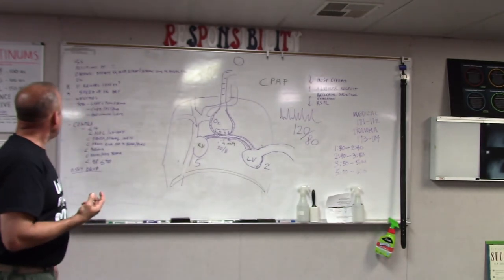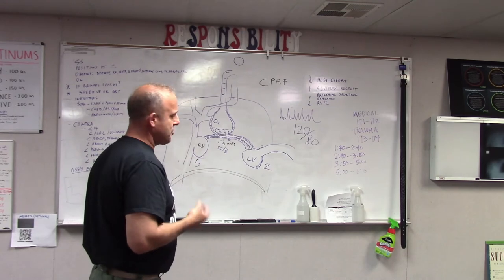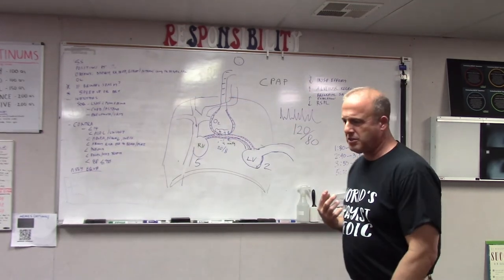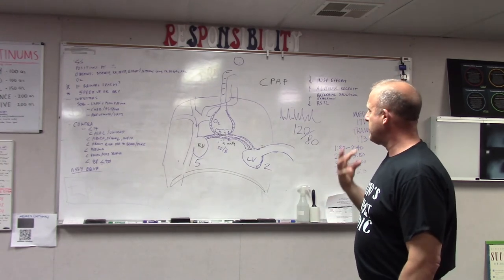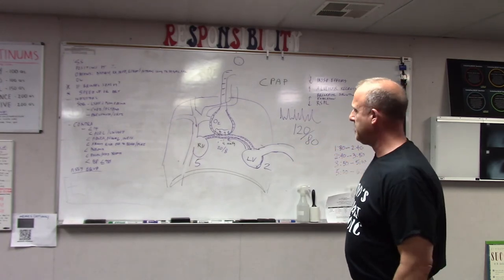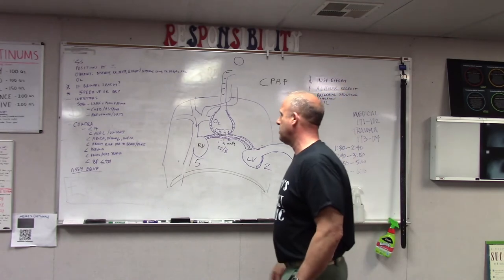What are the signs? Obviously, patient's distress level. Next thing, respiratory rate. Always check the respiratory rate. Respiratory rate is the biggest lied about vital sign in EMS. So this is where you want to put them on capnography right off the bat, because CO2 measuring that waveform works really well, as long as they're not talking or coughing too much. Otherwise, pay good attention to the respiratory rate if you need to with a stethoscope.